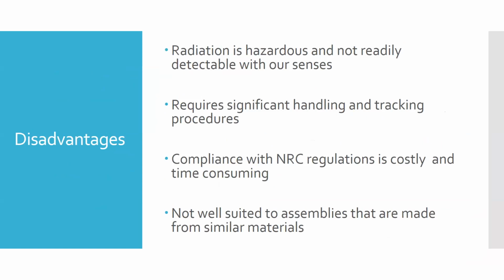Disadvantages, however, as we've all probably are aware, radiation is hazardous. We have to protect ourselves from it. That radiation, as it travels between the atoms and molecules, sometimes hits atoms and molecules, and hits cells in our body, and hits strands of DNA. And when it does that, it causes damage to them. And that damage can lead to, in humans, things like radiation sickness, short term, or long term. If you get high enough radiation sickness, it'll kill you. Or long term can lead to things like cancer.